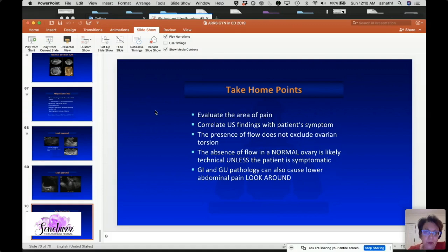So you have your scale down to like 5 or maybe 7 centimeters per second, sometimes even less. And then I crank the color gain up as much as I can until I have a lot of artifact, and then slowly dial it back down. That's what I do.